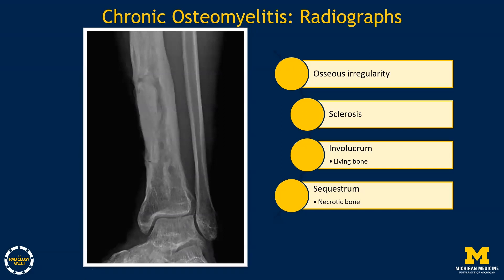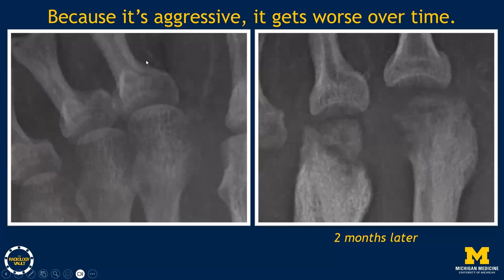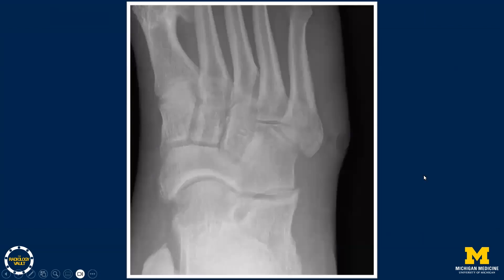With chronic osteomyelitis, there's osseous remodeling and irregularity as the bone tries to heal. On radiographs, it's possible to see the interface between the necrotic sequestrum centrally and the living bone or involucrum that forms around it. For example, radiographs showing normal second and third metatarsal heads at initial presentation can show lucency, erosion, fracture, subluxation at MTP joints, and sclerotic changes two months later. Similarly, a diabetic patient with an ulcer over the fifth metatarsal base may show soft tissue gas with cortical thinning and lucency in the metatarsal base, suggesting osteomyelitis.